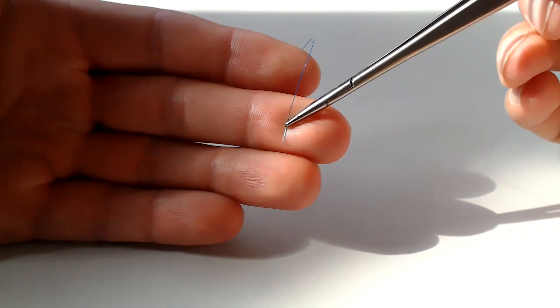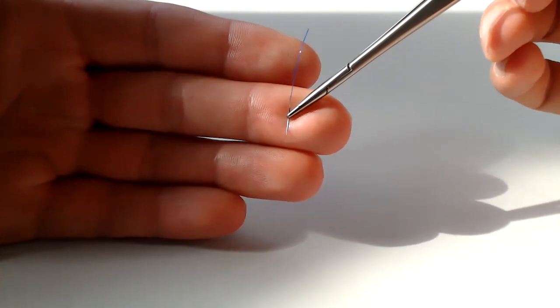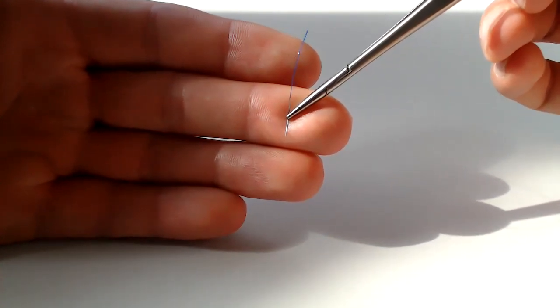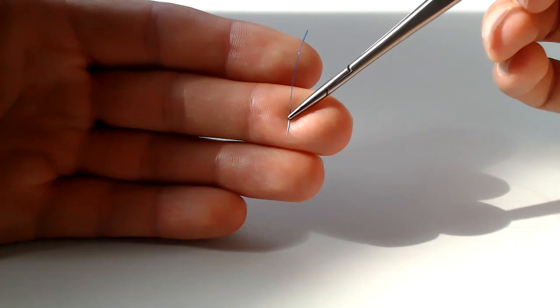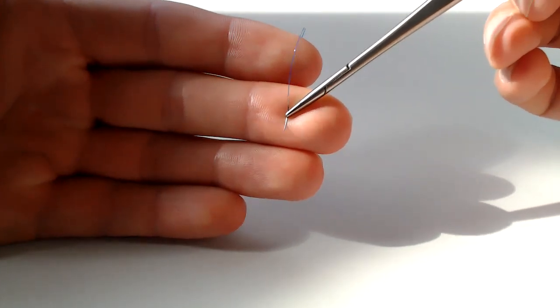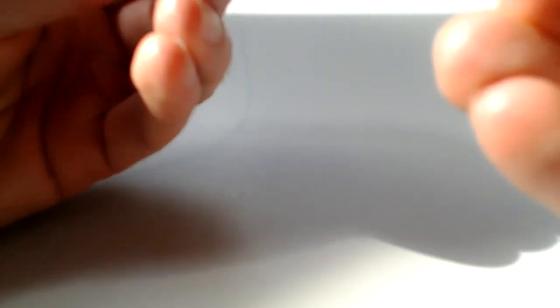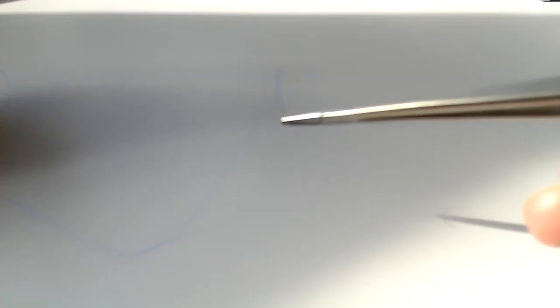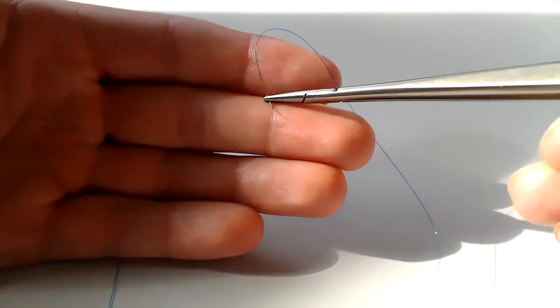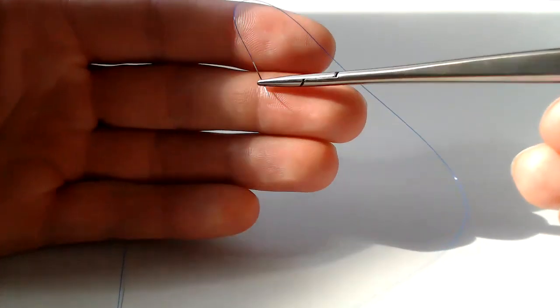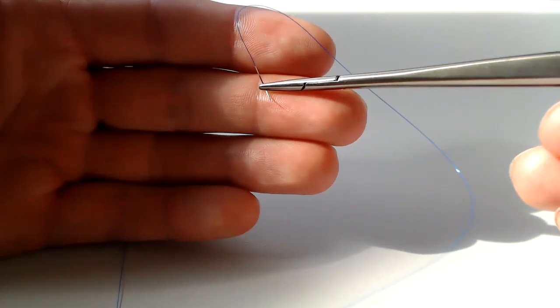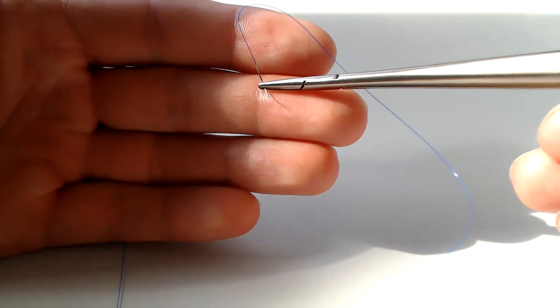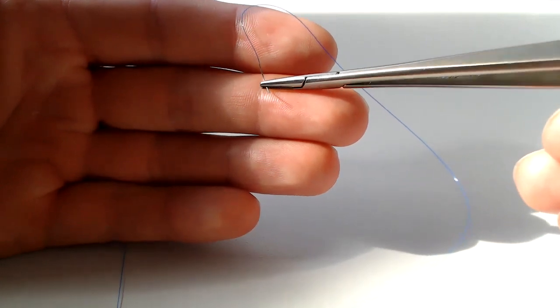I think with my hand behind it, the autofocus seems to work a little bit better. So in general, that's going to help you. There may be times where a little bit less of an angle could be helpful. There's almost never a time when this reverse angle will help you where it's kind of loaded up like a negative angle.